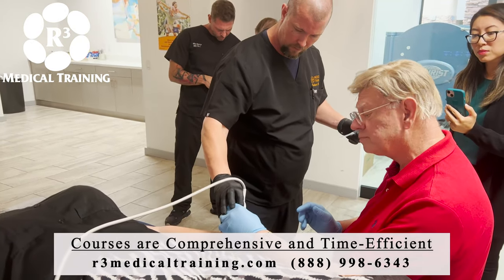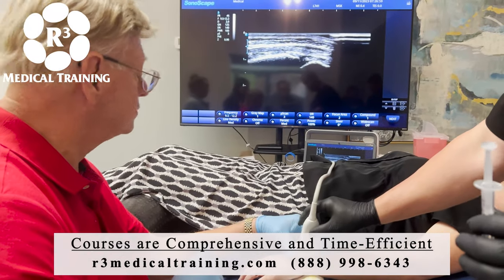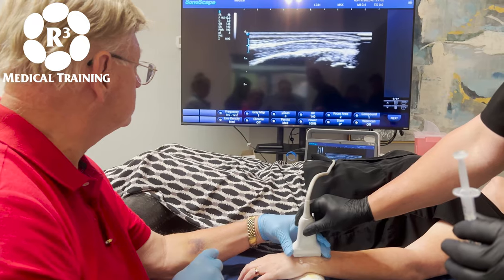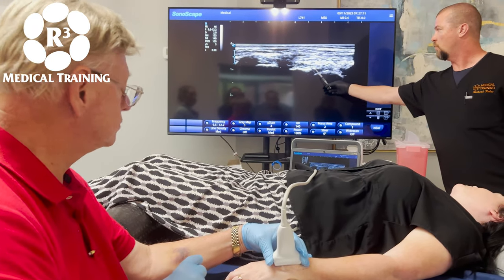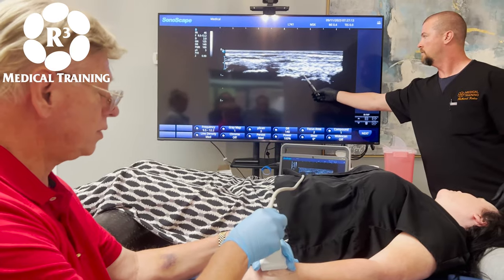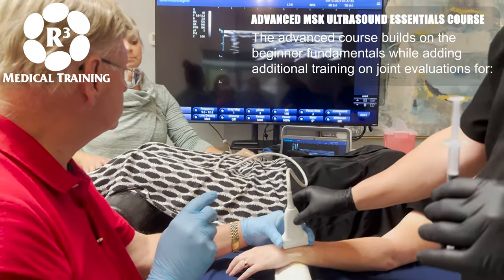All right, we have a little bit of drop off because we're not on the skin here. I want to drop just one cc right in here. Bring it back towards you just a little bit.